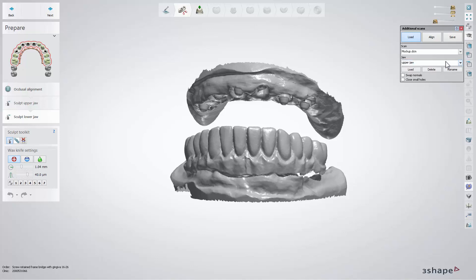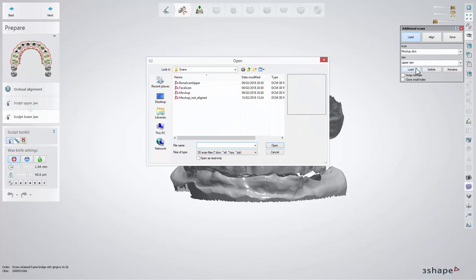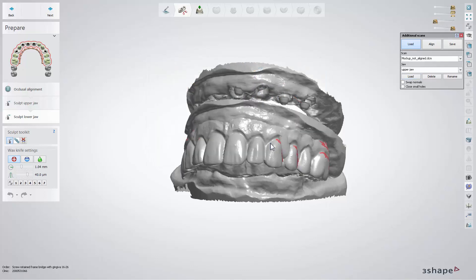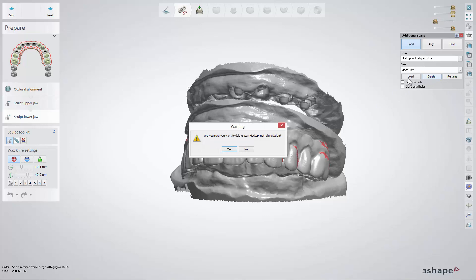Load allows you to add even more scans, delete some of them, or rename them.